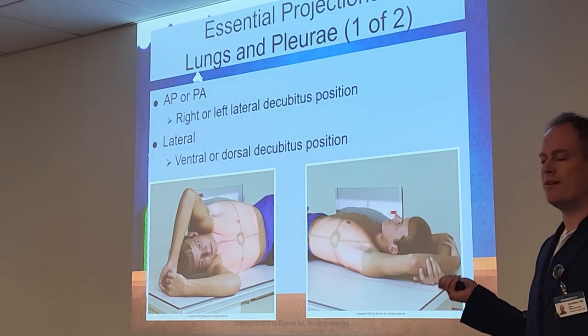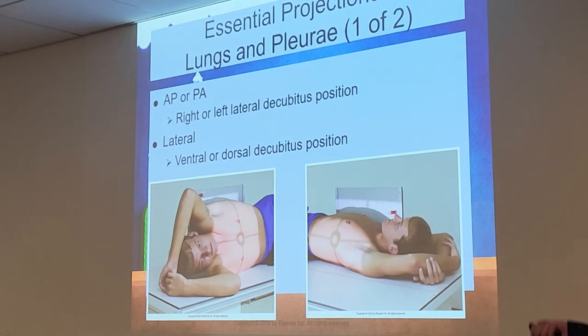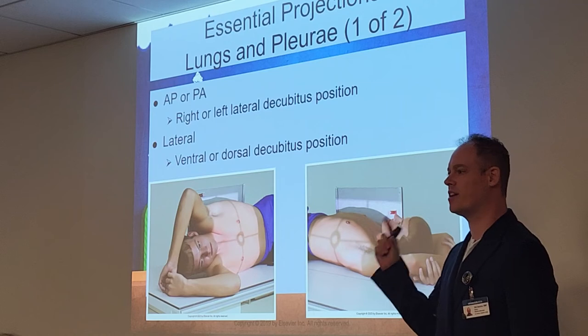Is everyone's favorite one in lab? Is it looking for fluid? Or least favorite? It's not that bad, just requires more setup. Yeah, okay. It's called a sideways chest. You can hang the film sideways.